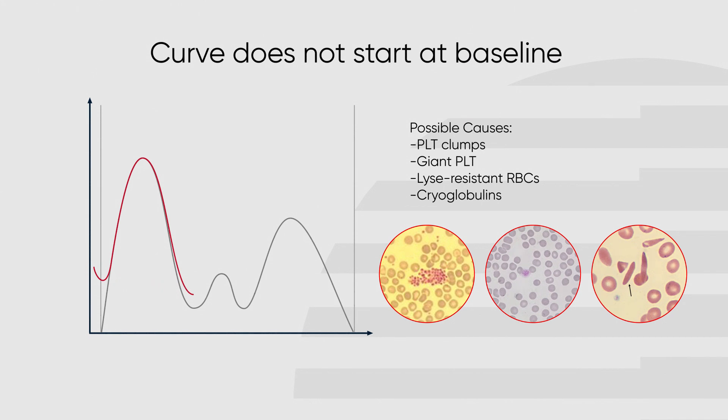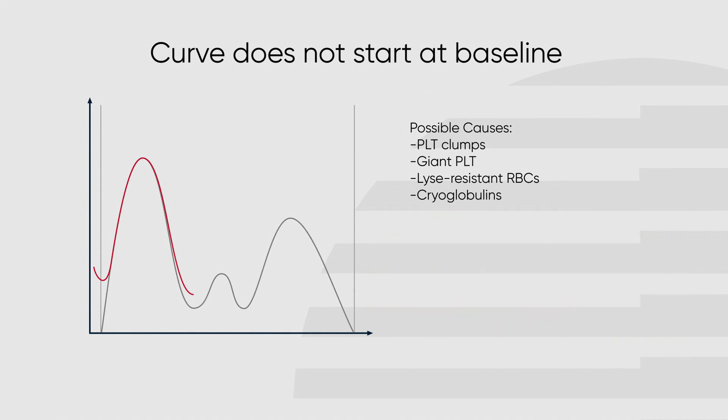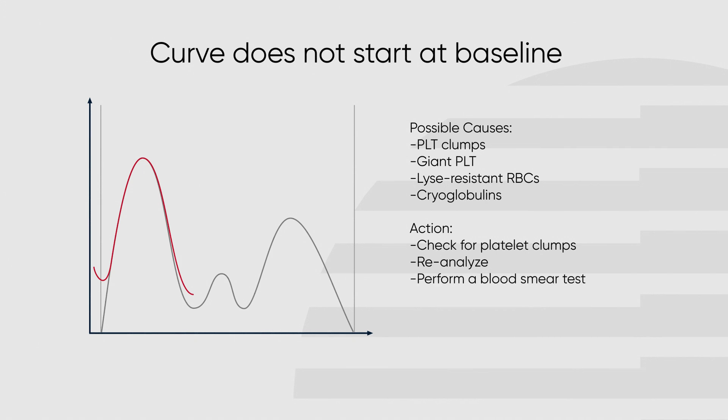This may also cause a falsely elevated white blood cell count. Check for platelet clumps; if they are found, take a new sample and analyze again. If no platelet clumps are found, proceed to manual smear.